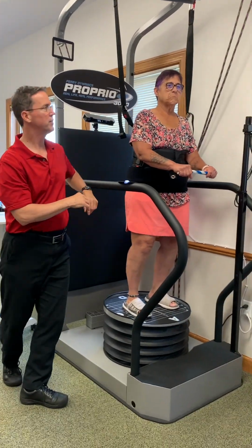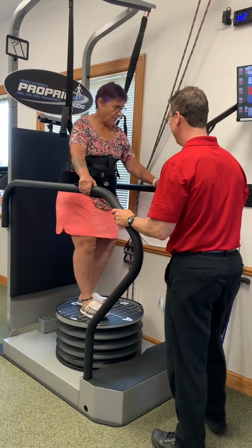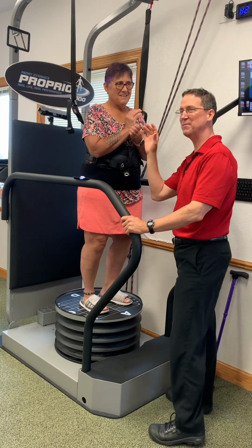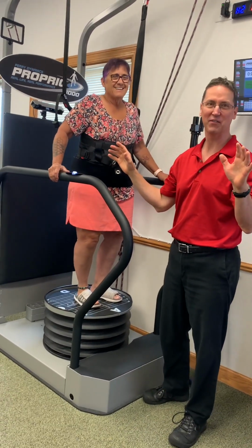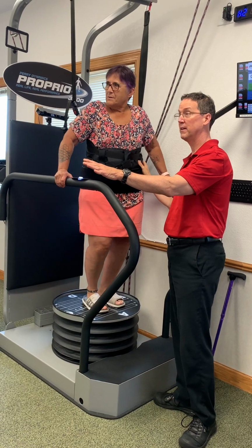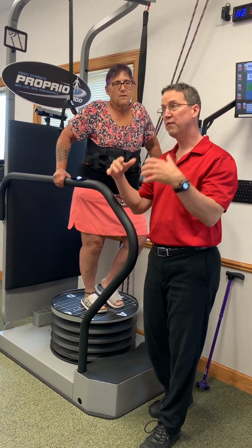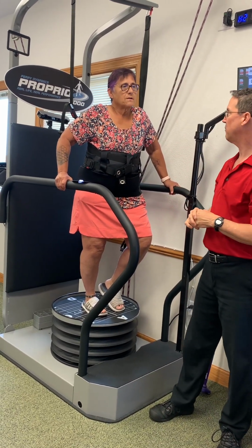And are you supposed to look at that smiley face the whole time you're on? Oh, all right, cut. Her nervous system is like, okay, I've had enough. Jane, get me off this crazy thing from the Jetsons, right? I'm sorry, what was the question? I just asked, are you supposed to look at the smiley face the whole time you're on? Well, typically we want a forward orientation. It kind of depends upon what we're doing.